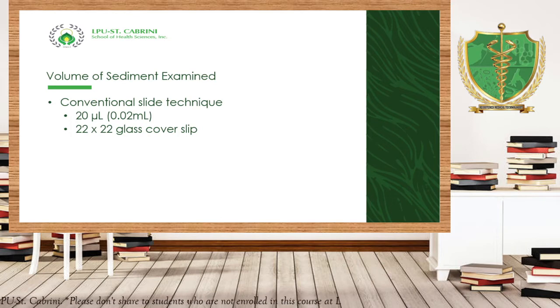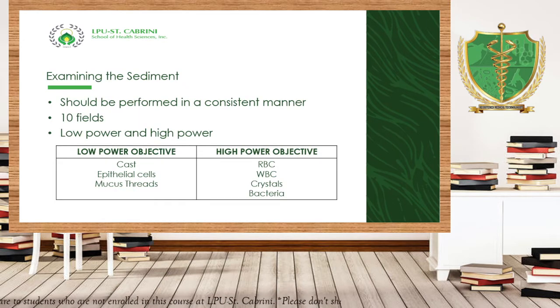And as per casts and crystals, usually they are seen at the edges of the cover slip. Sir, bakit po sila nandun sa mga edges ng cover slip? So let me write. I want to write. Let me write.